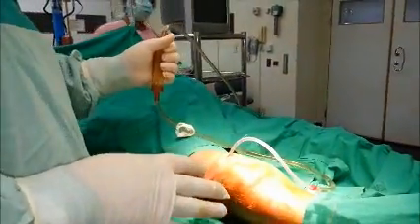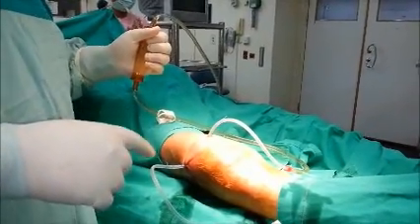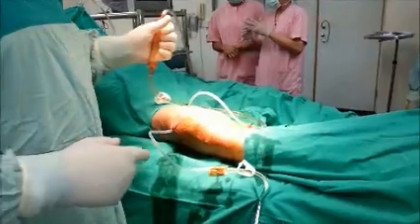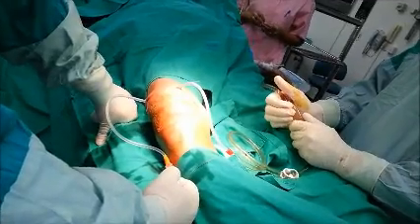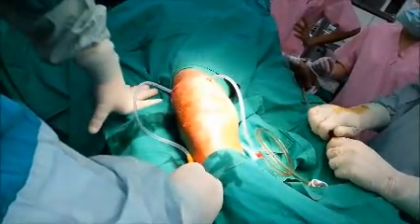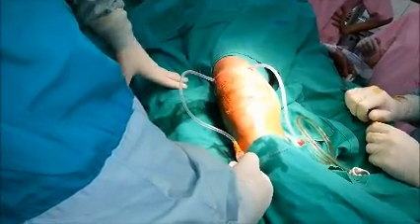Another advantage of this technique is that if we need another irrigation session for the patient after one or two days, we can do the same maneuver through the same tube without the need for another procedure. We can close this one, make filling of the joint so the water is inside the whole joint. We can see the joint inflating with the saline, then open it and it drains — inflating and deflating with the saline.